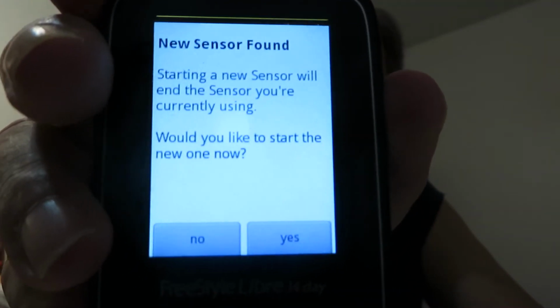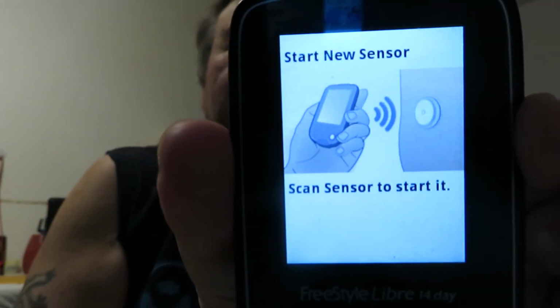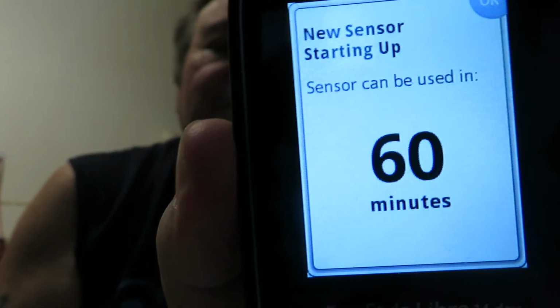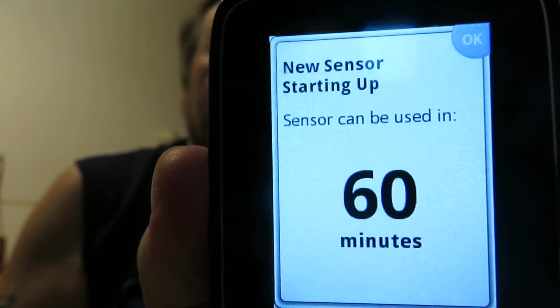I got the sensor, and now it's going to say, starting a new sensor will end the sensor you're currently using. Would you like to start the new one now? There, it should be in focus. And then there's yes. Gonna punch yes. Scan sensor. Start new sensor. Scan sensor to start it. There it is. And you knew it was going to say 60 minutes. You can start using it in 60 minutes. Takes a while to reprogram or something, whatever it does.